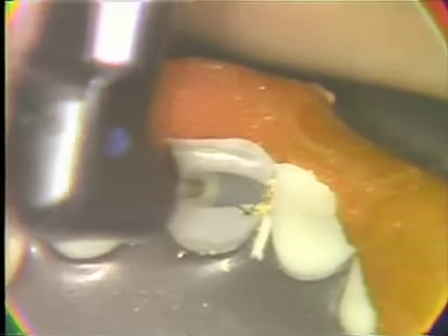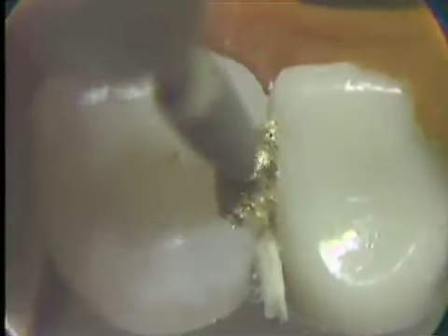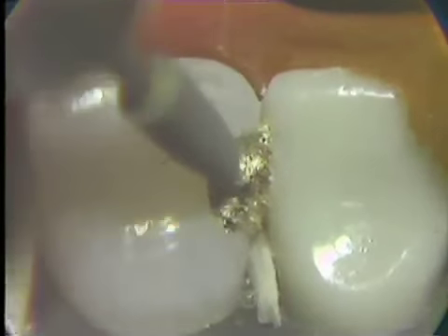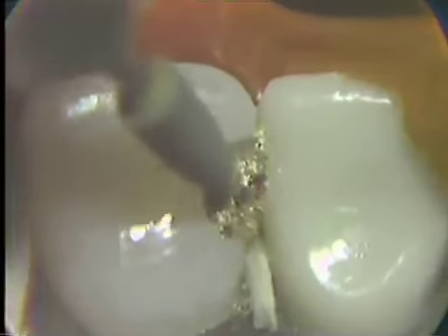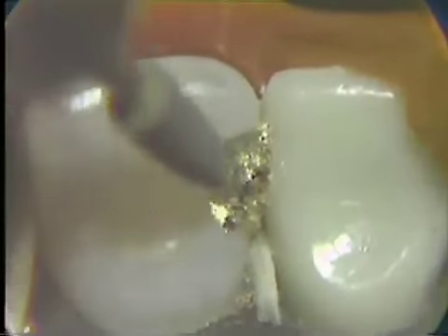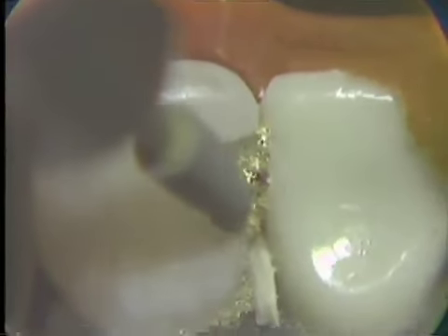At the incisal area here first. Uncovering the margin area, and then change rotation, and we'll be working a bit into that lingual concavity, developing that and uncovering our lingual margin area. Continuing this area on down then to the cervical position.